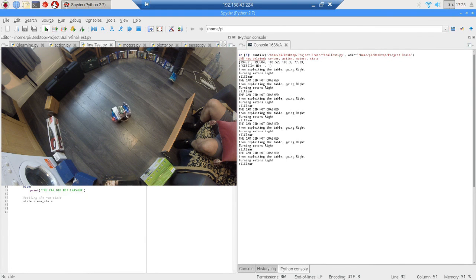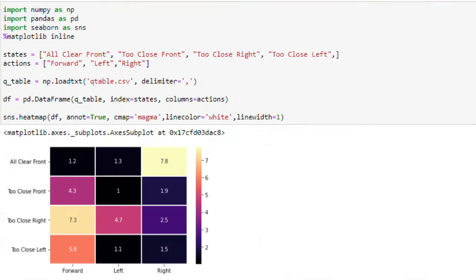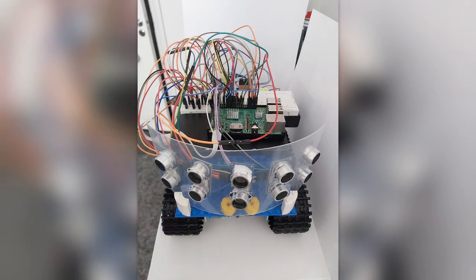We can see that the agent learned to go to the sides in order to avoid crashing. If we take a look at the Q-table, we can then see that if the agent has a state of all clear front, it will tend to go to the right. Of course, by doing this, the agent will never crash and will always obtain a reward. Although the final behavior was not the expected, the agent actually learned from the Q-table and the learning sessions.